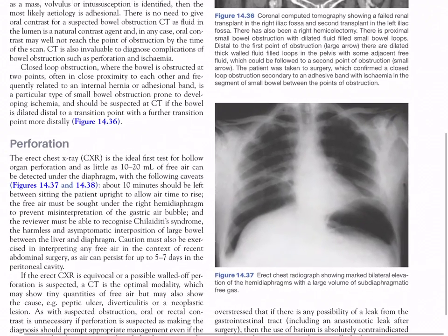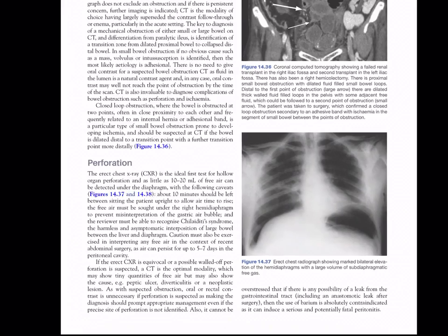This is figure 14.37, an erect chest radiograph showing marked bilateral elevation of the hemidiaphragms with a large volume of subdiaphragmatic free gas.